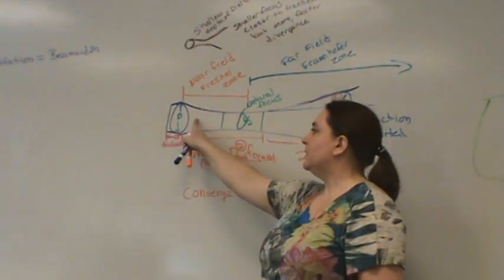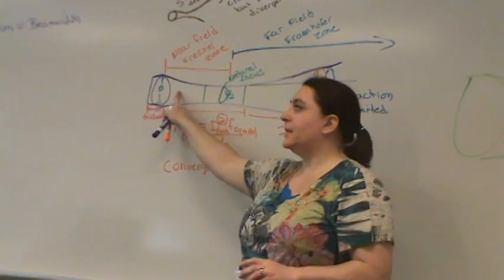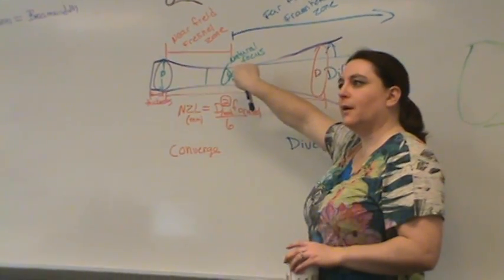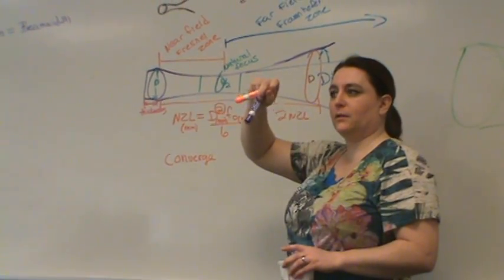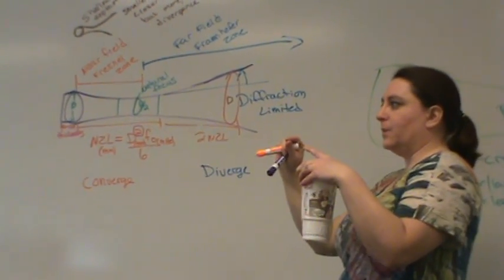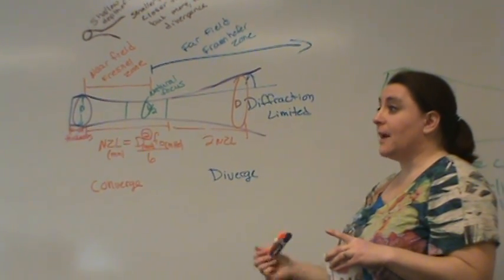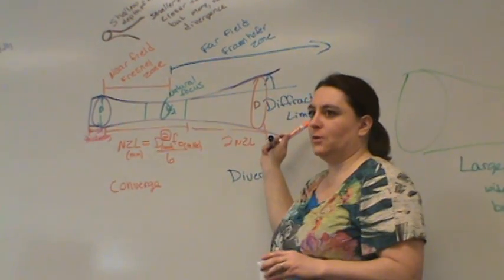In the near field, very, very close to the transducer face, we had those kind of broader pins because our beam starts out as wide as our transducer and then it narrows down. So when you were in the area of the focal zone, the pins were very small, like the little dots that they're supposed to be. But then as divergence occurred, those pins got spread out and looked larger and larger and larger. All of those pins are exactly the same size. We see them as different sizes because our beam shape changed.